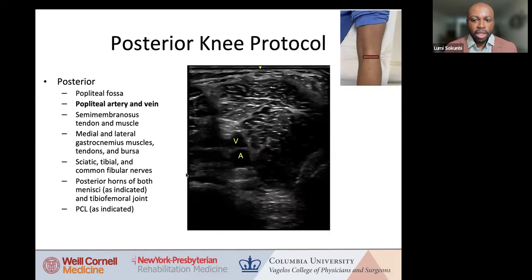Next up, sweeping the probe up and down over the popliteal neurovascular bundle, you can demonstrate the popliteal artery, which is typically deep, the popliteal vein, which is in a more intermediate position, and then the tibial nerve, which is superficial, and they are aligned in an oblique sagittal plane. In this prone position, the popliteal vein can tend to collapse and it's very compressible. So a small elevation of the leg from the examination bed and flexing the knee can help fill the vein to enhance its detection.